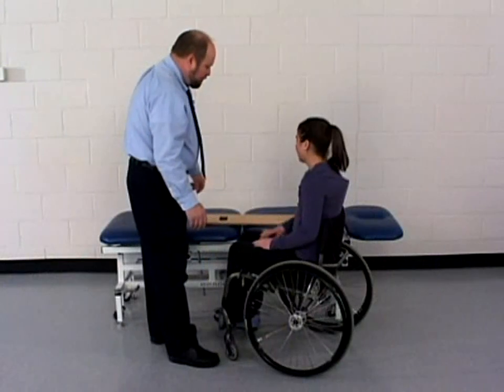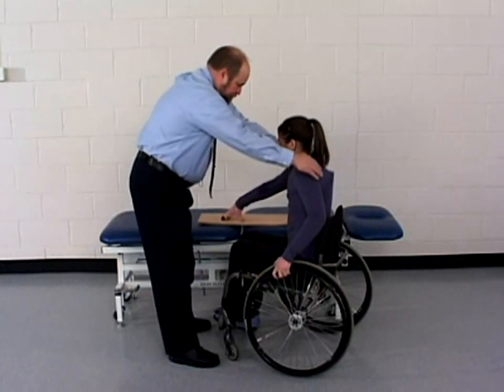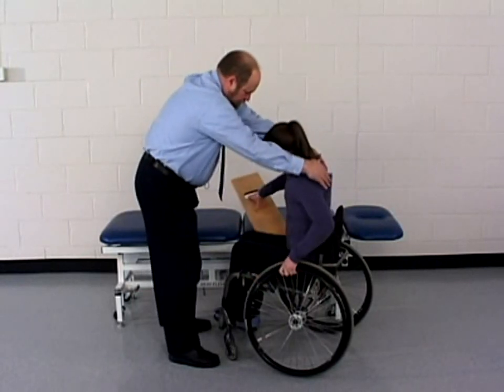The patient moves forward on the seat of the wheelchair and the armrest on the treatment table side of the wheelchair is removed.